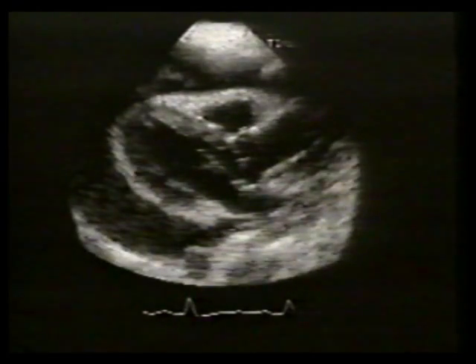This patient presented with a febrile illness and hypotension. In this parasternal long-axis image, a large pericardial effusion is easily identified. Notice that the fluid collects anterior to the descending aorta, thereby assuring that this is pericardial rather than pleural effusion.